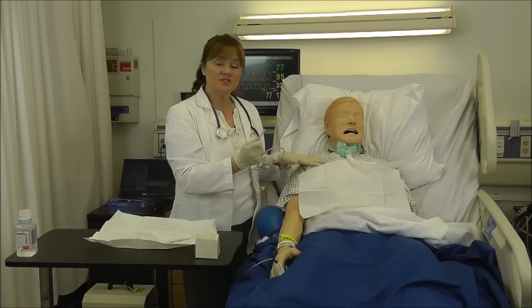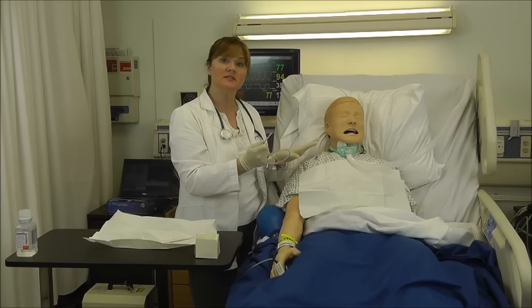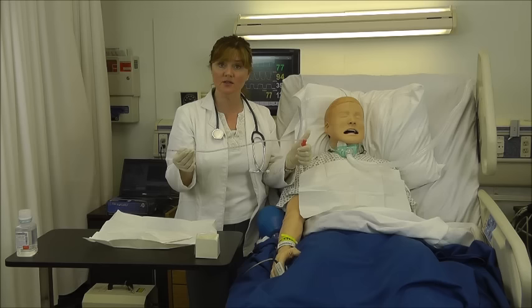With each pass, you can stay down for only 10 to 15 seconds, and you must give the client at least 30 seconds to recover. They'll be coughing quite hard, and they need to be able to settle down and catch their breath before you go again. So while I'm waiting that 30 seconds, I'll look at the secretions in the catheter. I want to note the color, the amount, if they're thick or thin, and if there's any odor. Now I need to clear those.